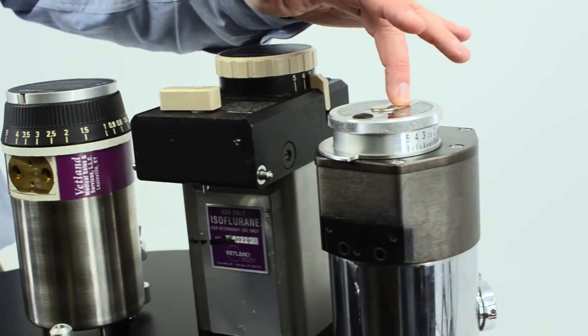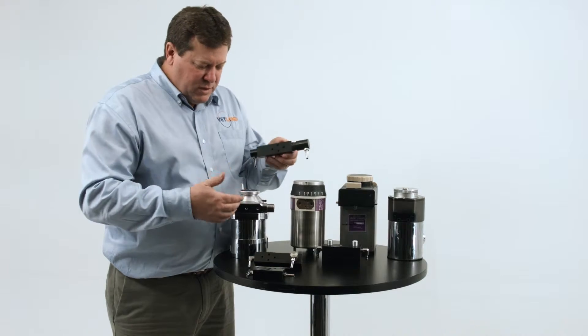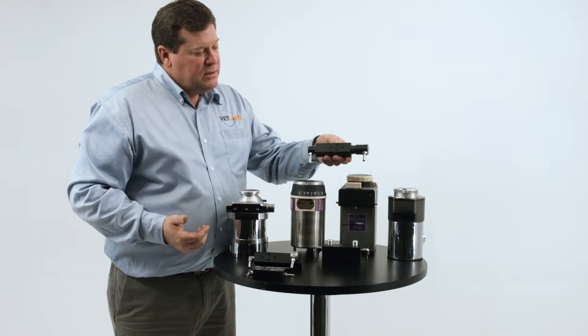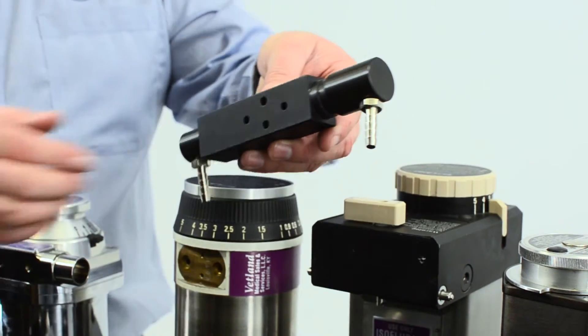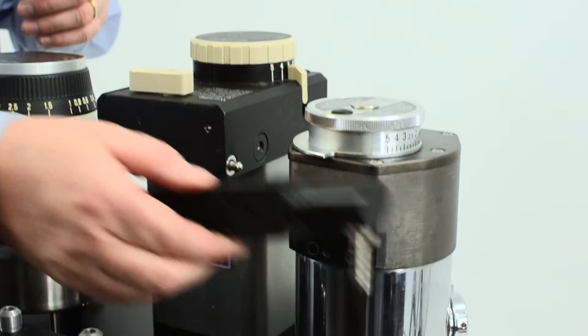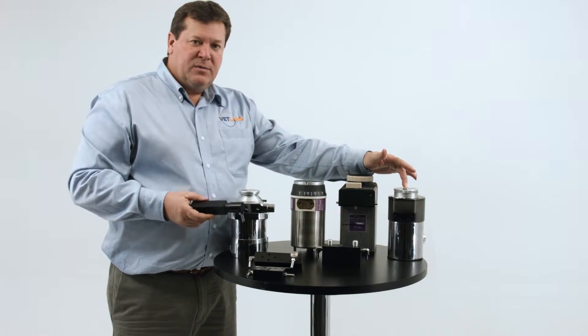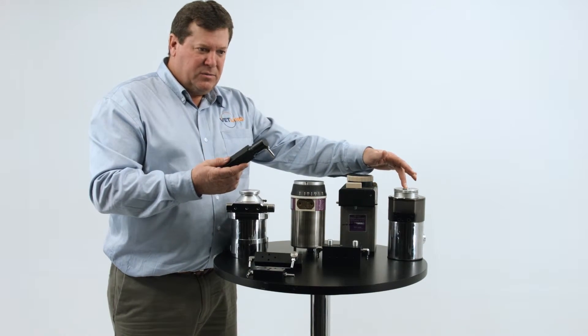For the Ohio vaporizer, we have the same 23 millimeter tapered fit manifold for the Ohio vaporizer. So if you purchase an Ohio vaporizer, you'll need the 23 millimeter manifold.